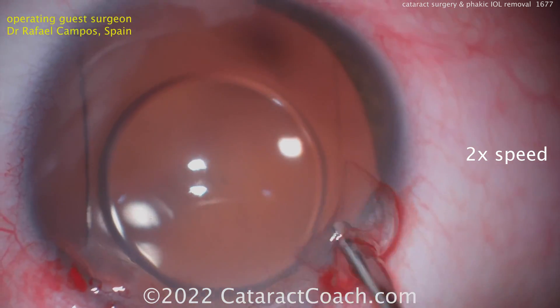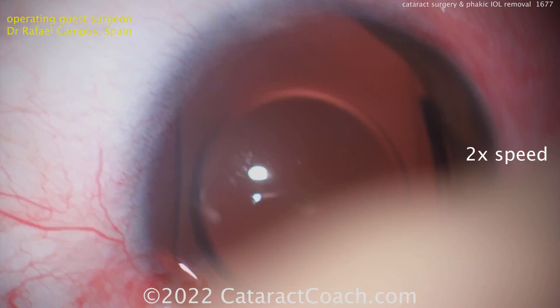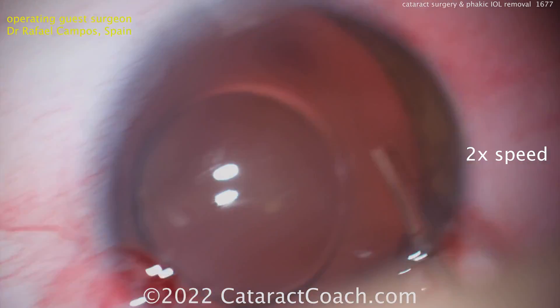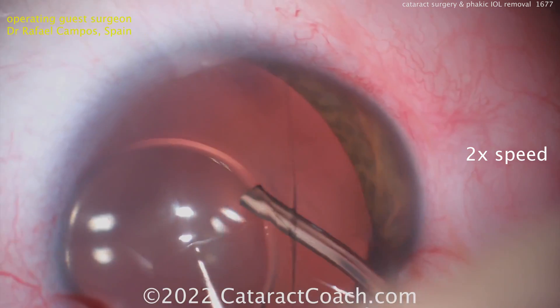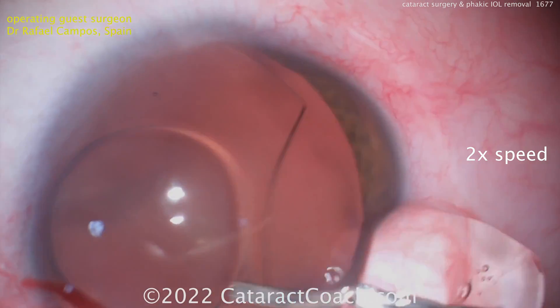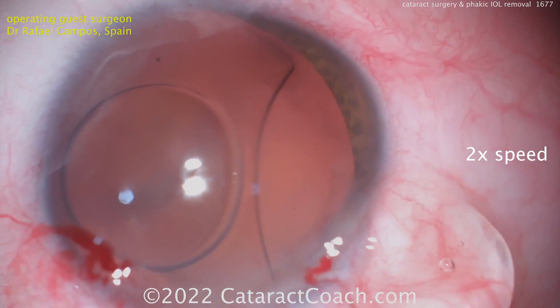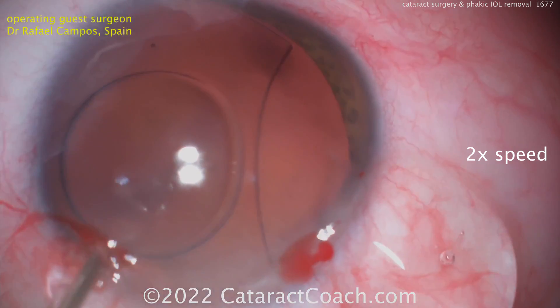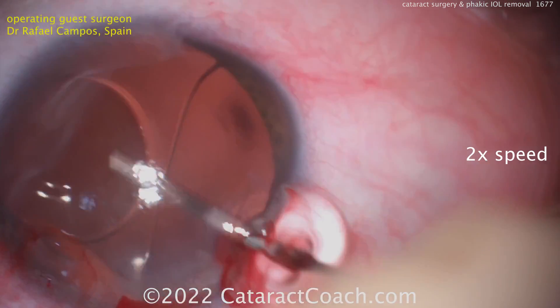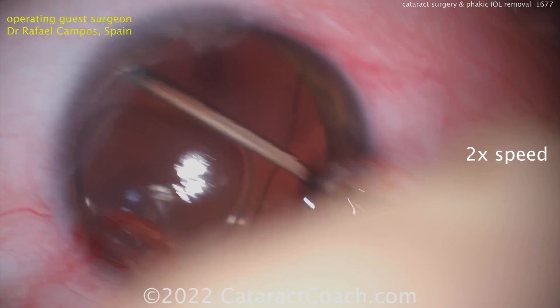There's the lens. Dispersive viscoelastic is your friend here. You can get underneath this lens, which is much thinner than a typical pseudophakic IOL. You want to inject viscoelastic underneath here — that's a dispersive agent — as you lift the lens up into the anterior chamber. This lens is very flexible and fragile, and you can tear it.